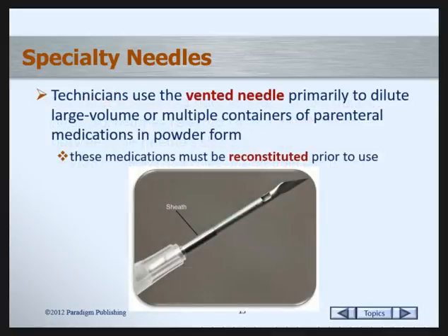Other specialty needles include the vented needle. Vented needles are primarily used to dilute large volume or multiple containers of a parenteral medication in a powder form. These medications must be reconstituted prior to use. A specialty vented needle has a razor-sharp tip without an opening in the tip.